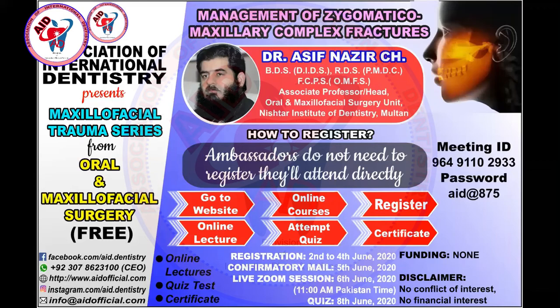Either transverse or figure of eight. And if you have reduced and no wire was used, then you fix it with a 4-hole plate or 5-hole plate. The rule of fixation is that the central hole should be on the fracture line, and two holes or screws should be fixed on each side of the fracture line. And if it was not so displaced and you can fix it with a 4-hole plate, then all screws go on the sides of the plate, with just the intermediate area of the plate on the fracture line.